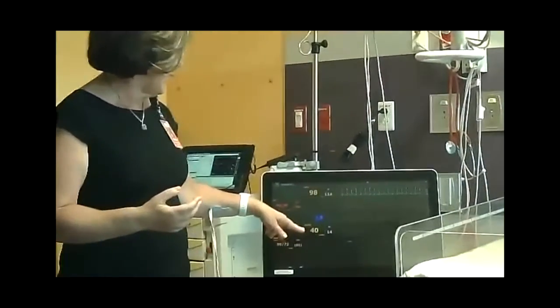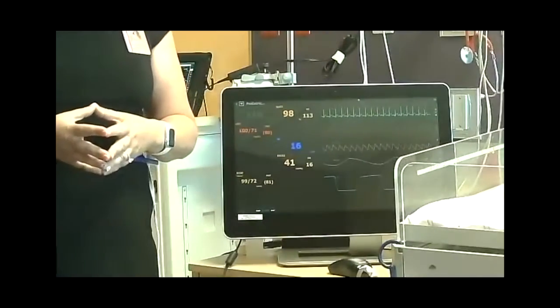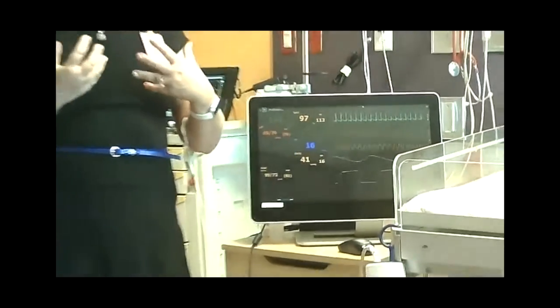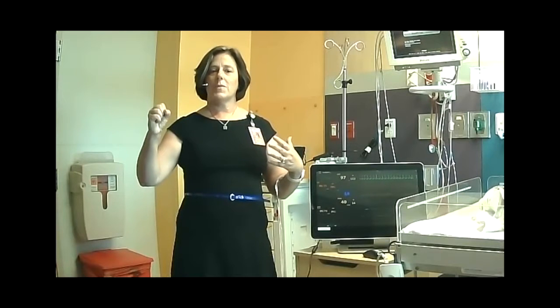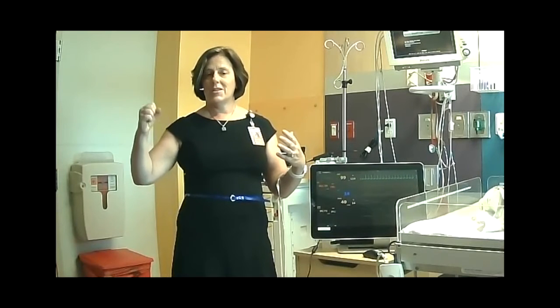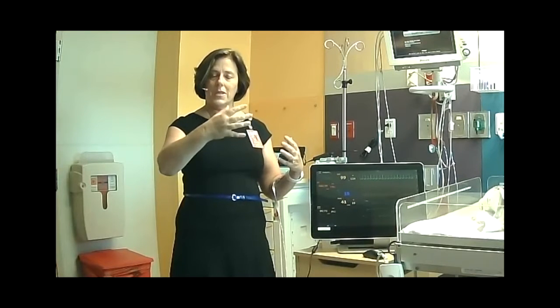One other component on here is something a little more advanced called an end-tidal CO2. When you breathe, you take a breath and the heart and the lungs are connected, right? The heart's job is to get blood to the lungs so that the lungs can then exchange, right? So the heart brings the blood to the lungs. There's carbon dioxide from the body exhaling into the blood. So that carbon dioxide goes across into the lung to exit the body through the breathing. What also happens there is oxygen's there. So oxygen is picked up by the blood and then goes back to the heart to turn it around.